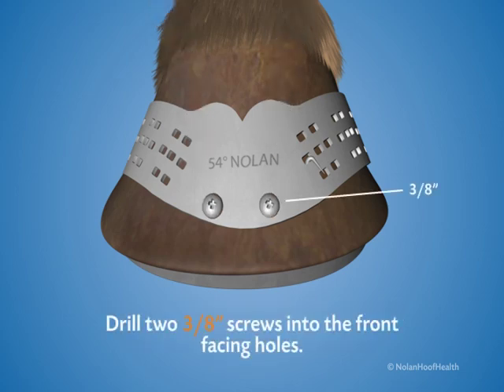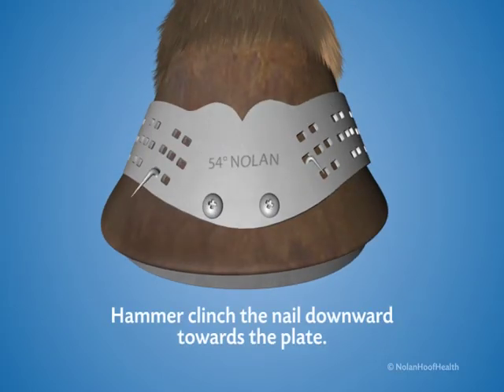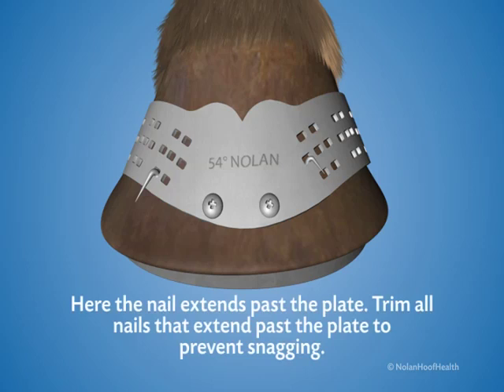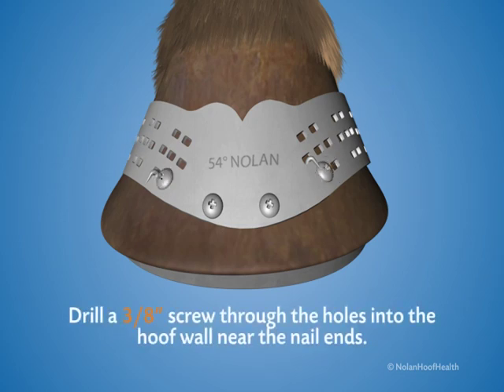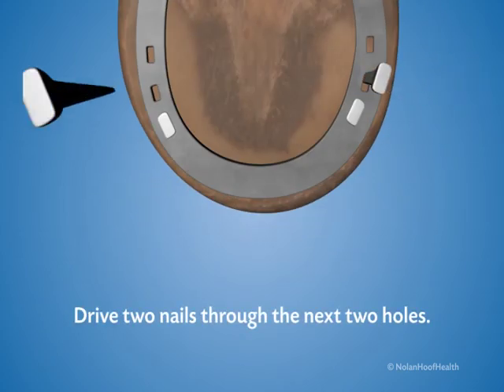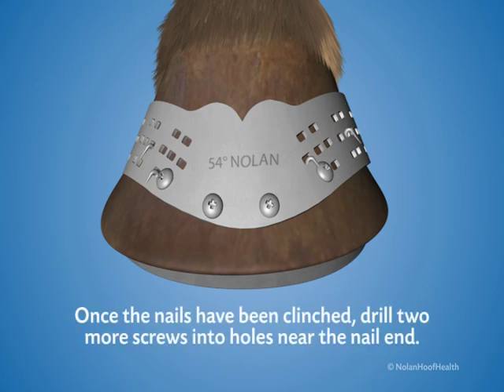Drill two 3/8 inch screws into the front facing holes. Drive a nail through the other front hole, making sure to drive a high nail. Hammer clench the nail downward towards the plate. Trim any nails that extend past the plate to prevent snagging, taking care not to trim the nail too short. Drill a 3/8 inch screw through the holes into the hoof wall near the nail ends. Drive two nails through the next two holes and repeat the same process. Make sure the plate is flat against the hoof wall before clenching. Once the nails have been clenched, drill two more screws into the holes near the nail ends.